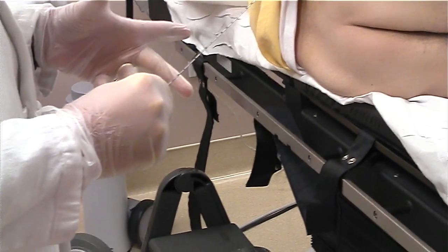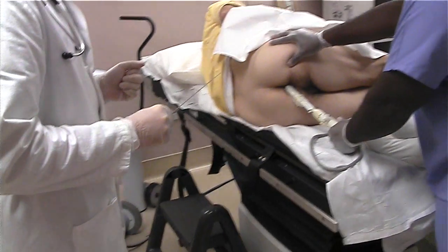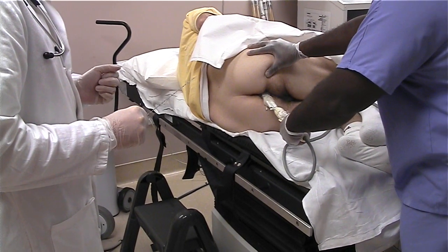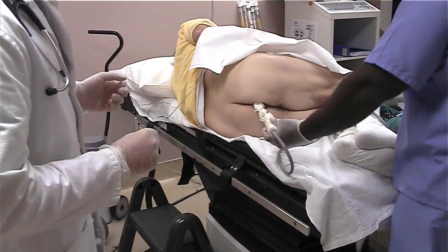Mr. Klein, I'm going to go ahead and get started here, sir. What I'm going to ask you to do is take a nice deep breath in — this is the general insertion. Let's have you take a deep breath in for me and slowly breathe out. Fantastic. There we go. That goes a little pressure.